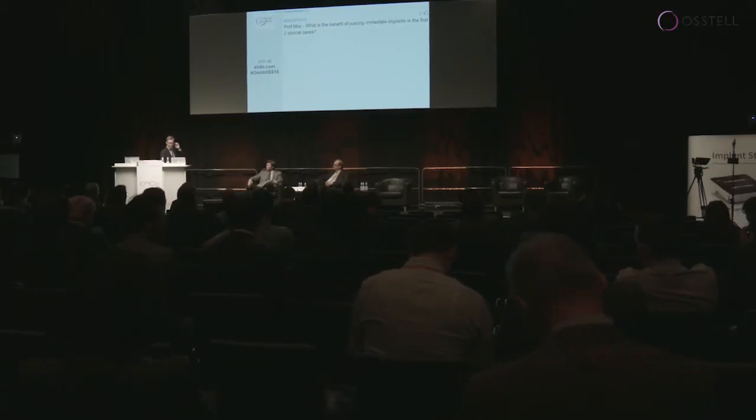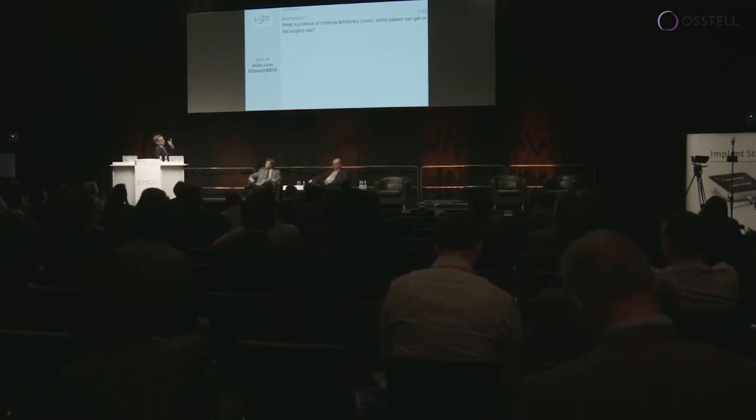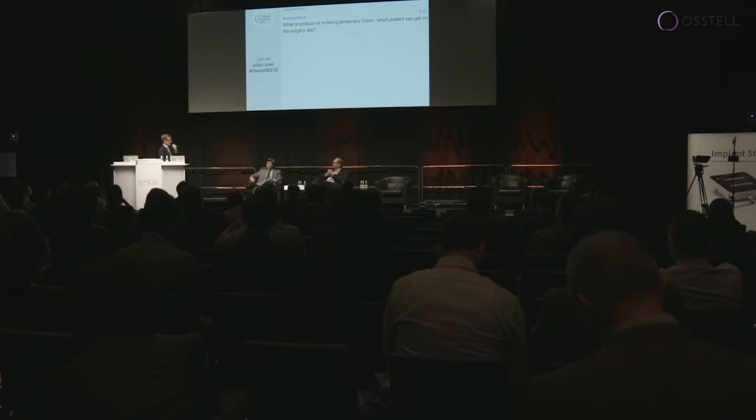So let's say that you actually decide to immediately load then the implant on the day of surgery. What will be the protocol of ordering the temporary crown? I mean, I have my way of doing it slightly, and you sort of presented something else. Could you comment upon that, Peter? Yeah, well, I personally don't fabricate the provisional crowns, and so I work with a lot of referring clinicians, who literally come over to my practice. And once the implant has been placed and we've achieved the ISQ value of above 65, they fabricate the provisional chair side. Yeah. Now that is with unguided surgical placement.